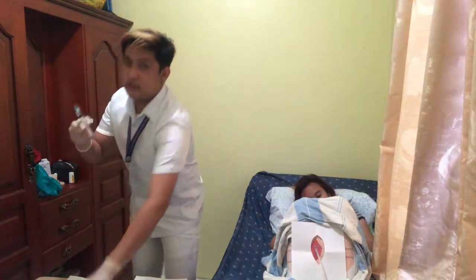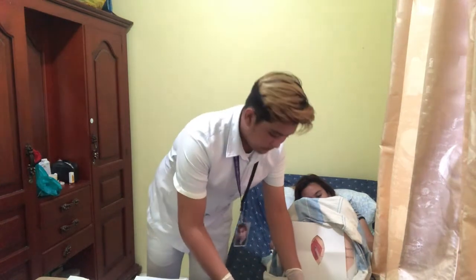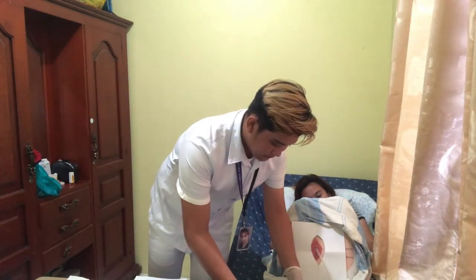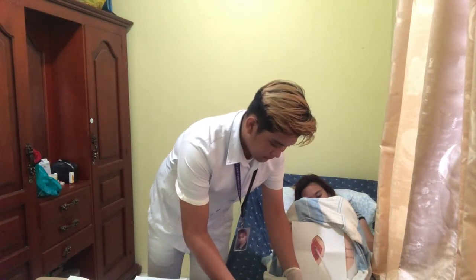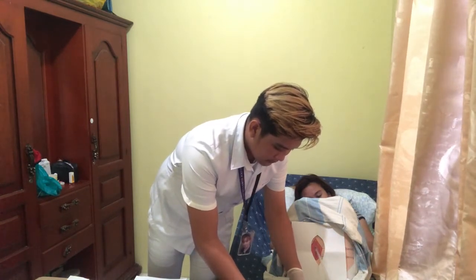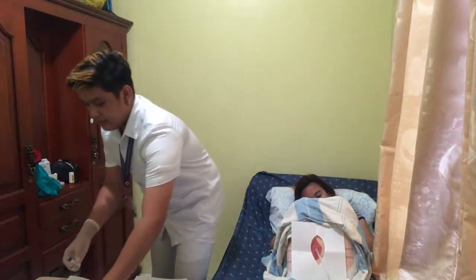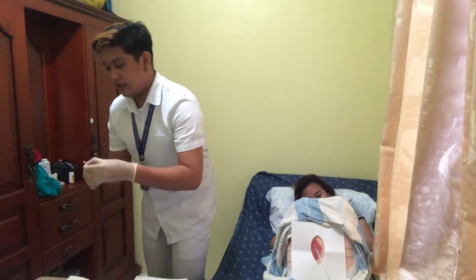Okay, we'll hold this in the proper position. Discard the syringe, and after that we'll secure the indwelling catheter by taping it to the patient's thigh.